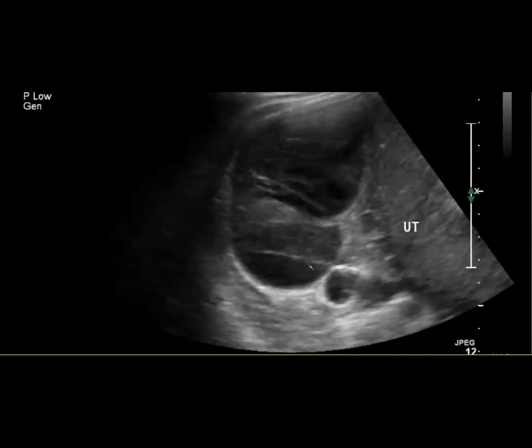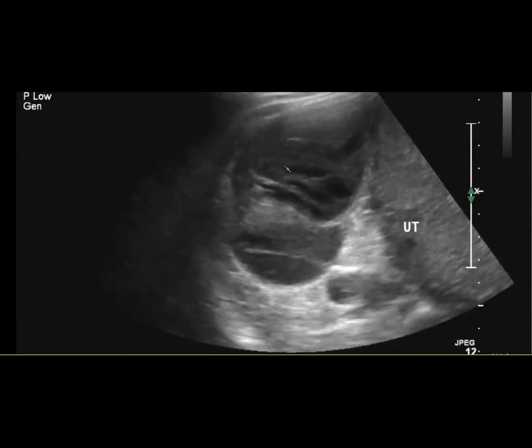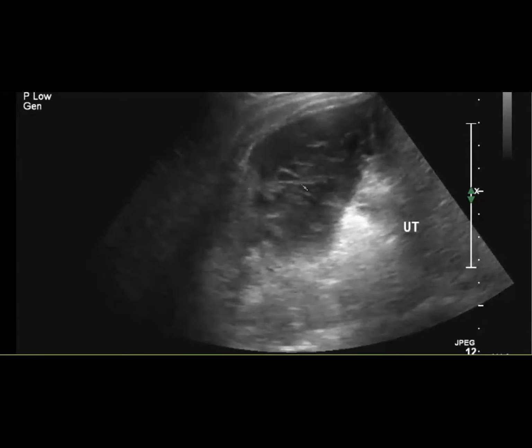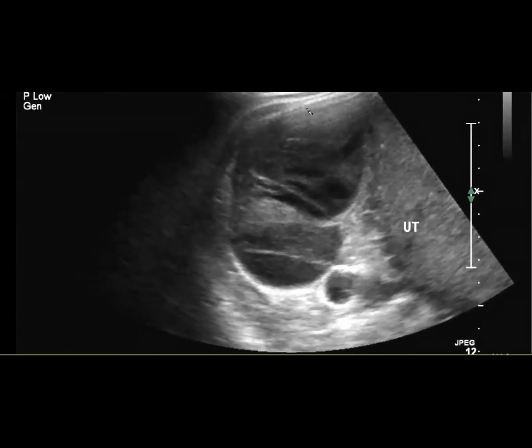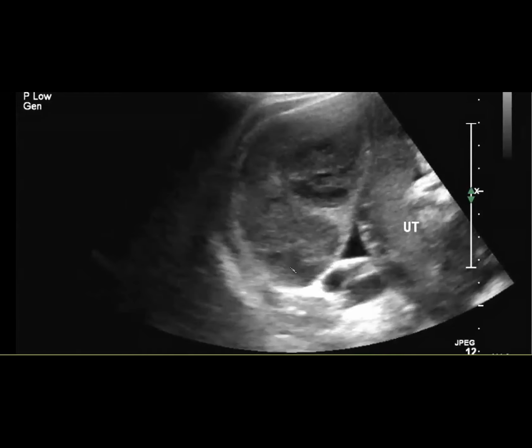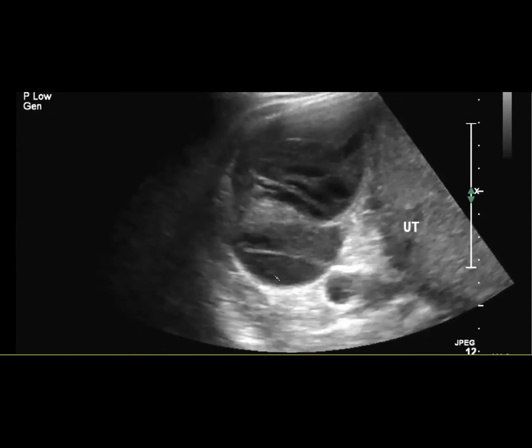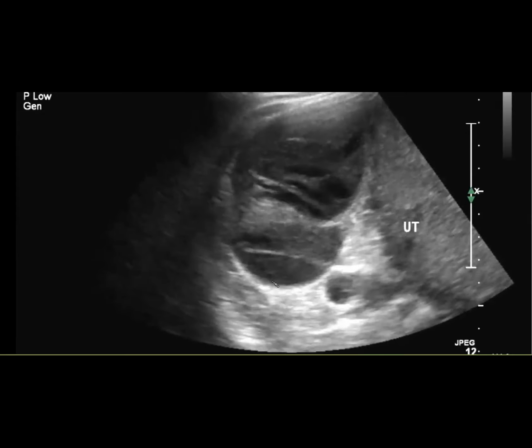I'm doing a cine through the ovary, I think. Yes. Which I think is that big hemorrhagic thing. Maybe in retrospect, that's the hemorrhagic cyst part and that's part of the ovary. Yeah, you're probably right. So at that time we thought that this was also an enlarged ovary torsed, but we didn't comment on a cyst. Either way, they have to go to the OR. And it would be very hard to call prospectively. Yes.